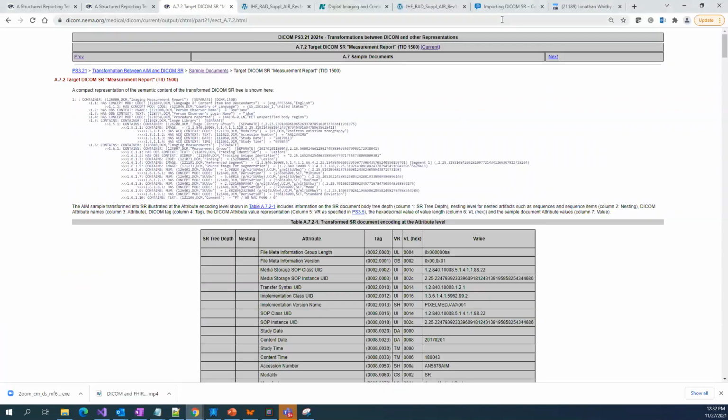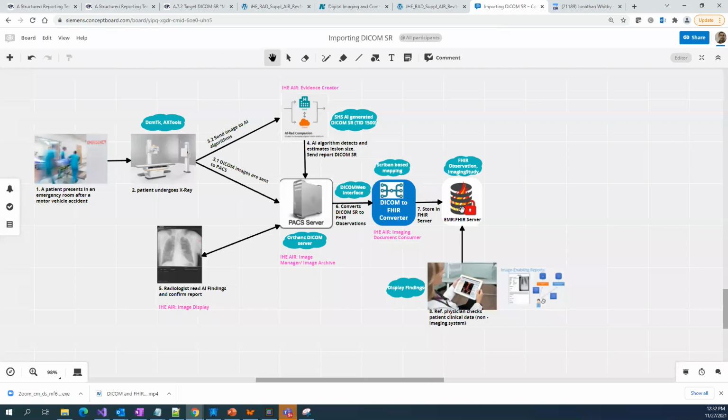If you see, our FHIR implementation track can also help us on the DICOM FHIR server, and the FHIR starter track can help us in creating a small application which you can view, and this terminology server can help us in that mapping.